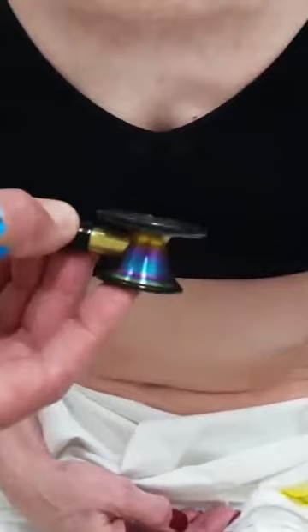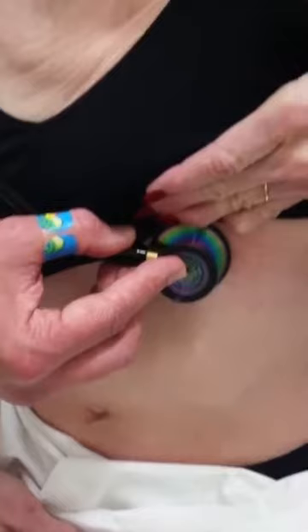In this case I will ask my patient to lift their left breast slightly. I will then place my diaphragm on the mid-clavicular line to auscultate the mitral valve listening post.